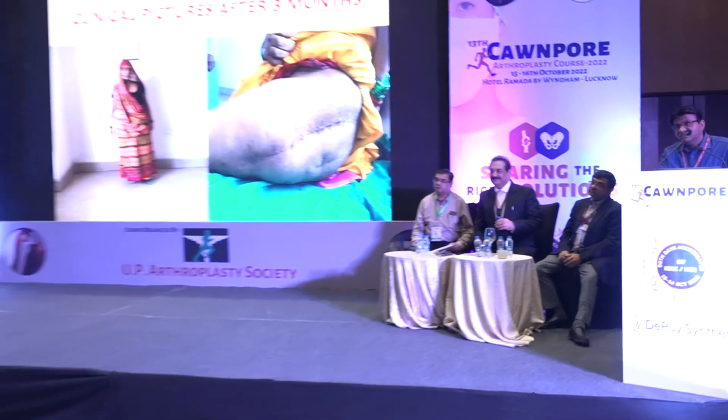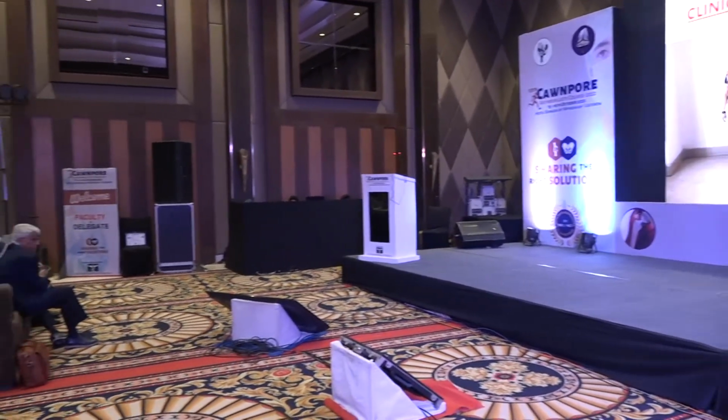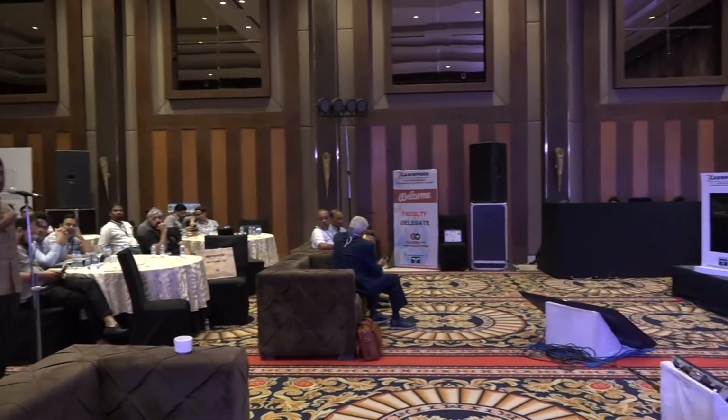Sir, can I make a quick comment? I think the general rule to be followed when you make a window, it shouldn't violate more than 1/3 the diameter of the tube. And I think yours was almost hemi-circumference. In that situation, you will have a problem with the distal propagation of a crack or even the proximal for that matter.